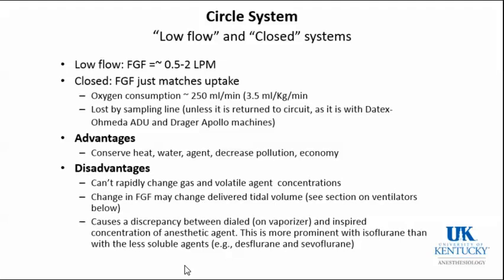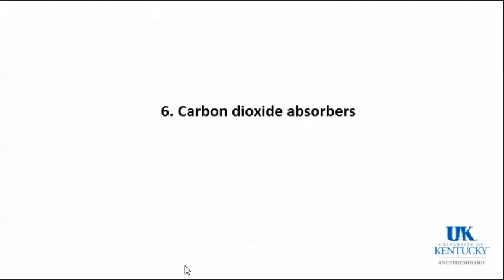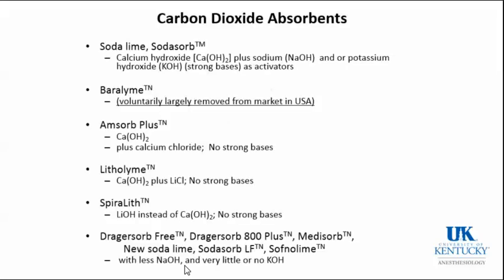So the lower and lower the fresh gas flow, the less and less what's going to the patient matches what your settings are in your vaporizer. And I've explained this in more detail on this particular slide. So, CO2 absorber we'll cover in a minute, I think, because the principles are pretty straightforward.